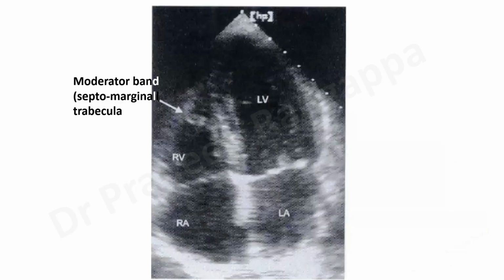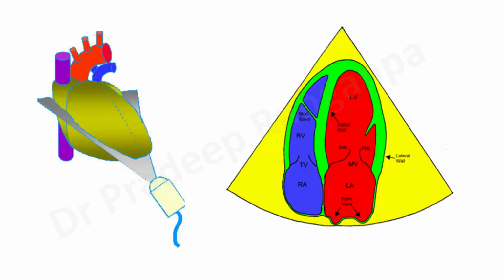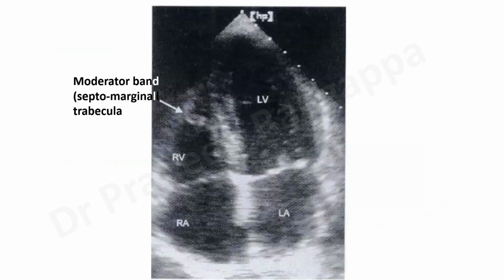The reason is when you're doing the four-chamber view, the wall you see on the right side is the lateral wall. But when you turn anti-clockwise, you will get three-chamber and two-chamber view. So in the two-chamber, we see the anterior wall here, which I will show you, and then we'll see the inferior wall. So when you do a three-chamber, you would see anteroseptal and posterior wall, and this is important for all the trainees to recognize when you're doing apical view.